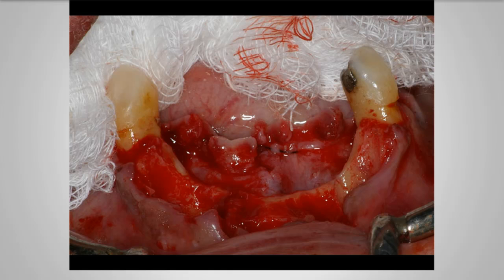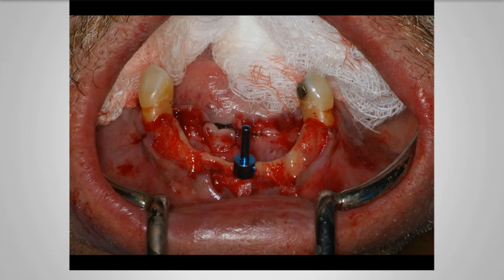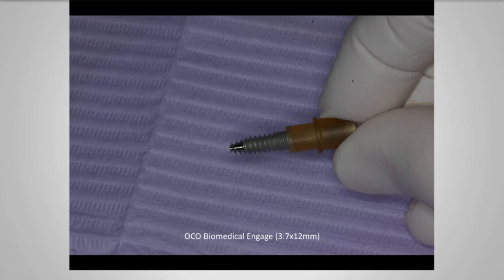As you can see, we've sutured the floor of the mouth out of the way, and we start to level the bone. This is something that I've learned at the Misch Institute from Dr. Carl Misch. We maintain the premolars so that we can position our A to E position, since we were not using a surgical guide in this particular case.